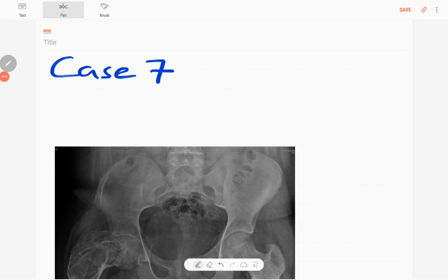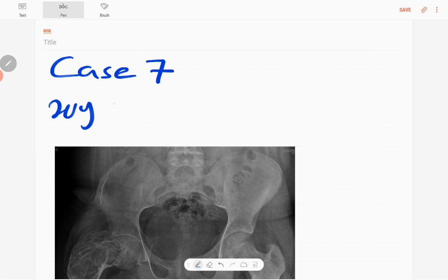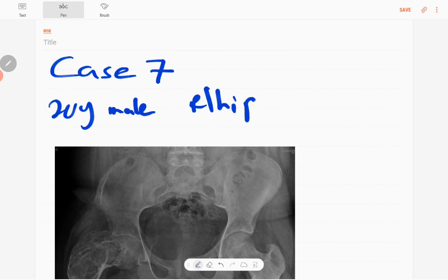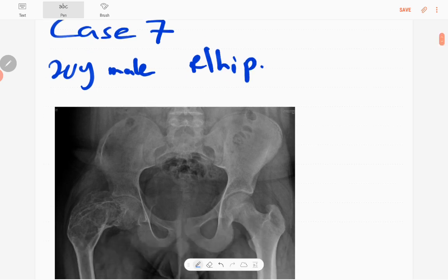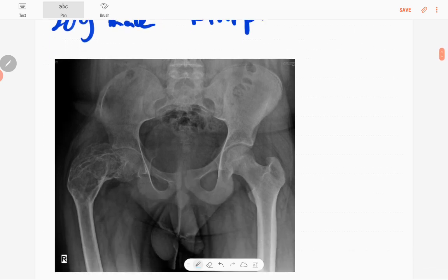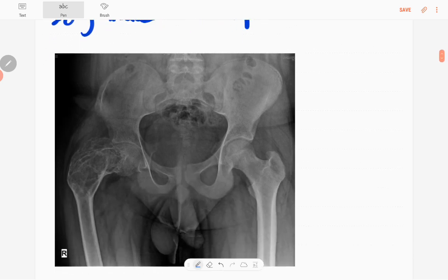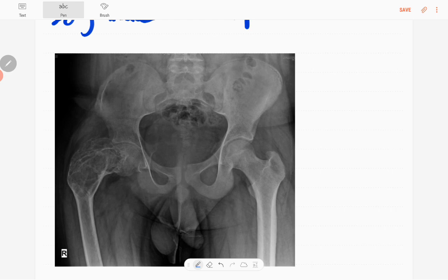Hi everyone, this is case number seven of MSK series. This case is a 20-year-old male patient presented with sudden onset right hip pain. This is the anteroposterior radiograph of that male patient of the pelvis and including the upper femurs.